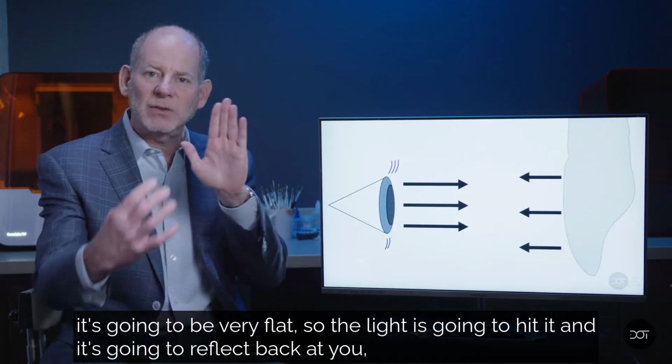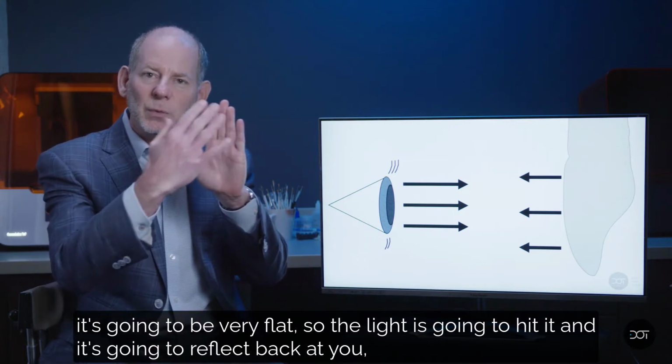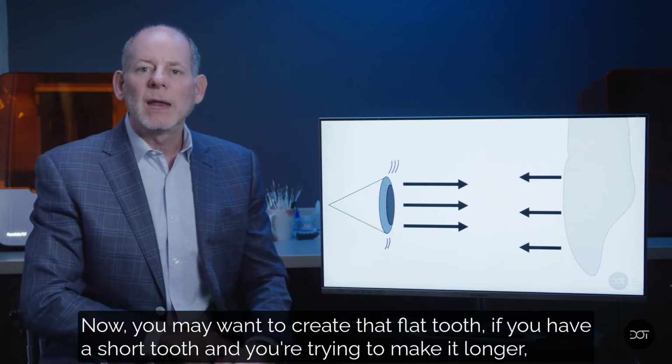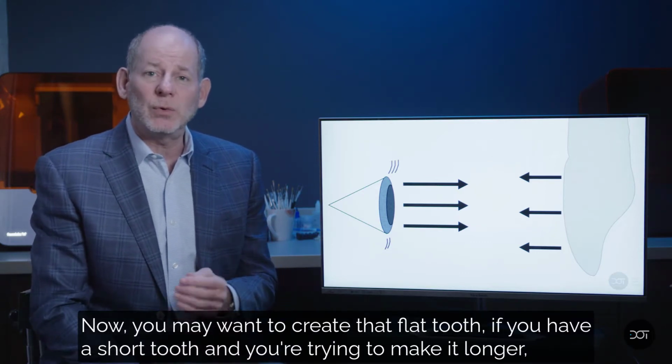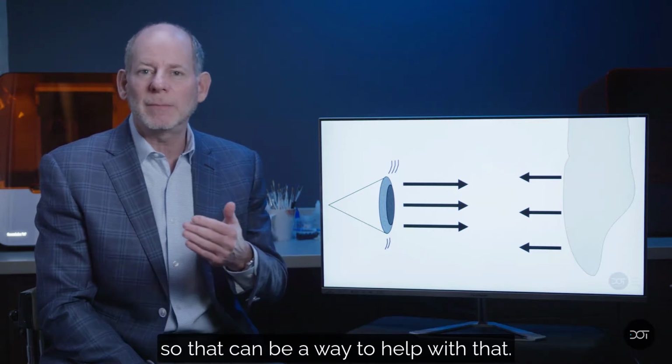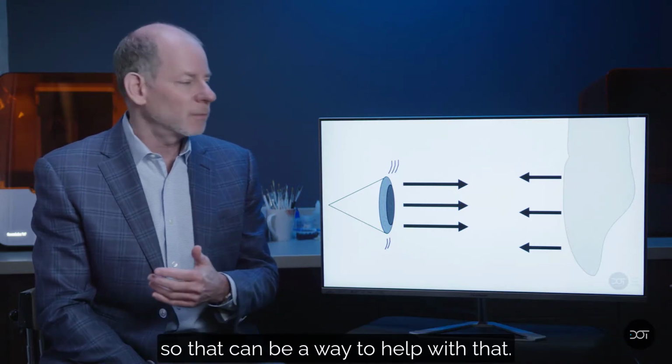It's going to be very flat, and so the light's going to hit it, and it's going to reflect back at you, creating the image of a long tooth. Now, you may want to create that flat tooth if you have a short tooth and you're trying to make it look longer. So that can be a way to help with that.